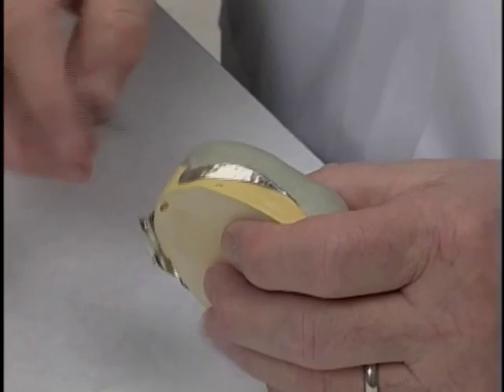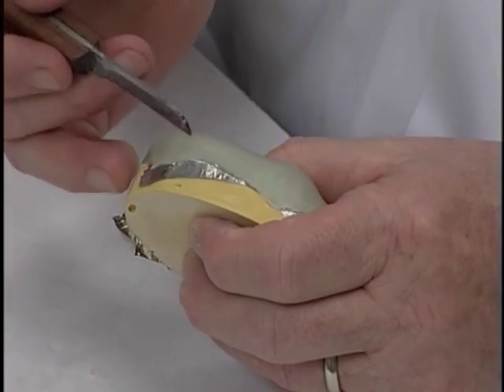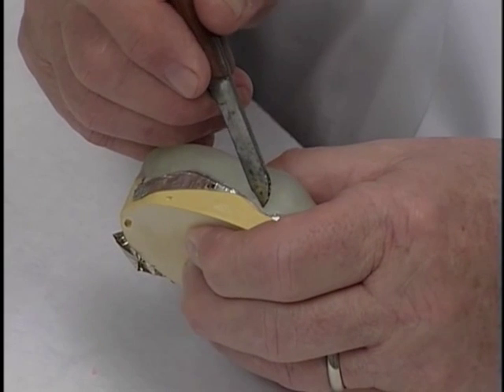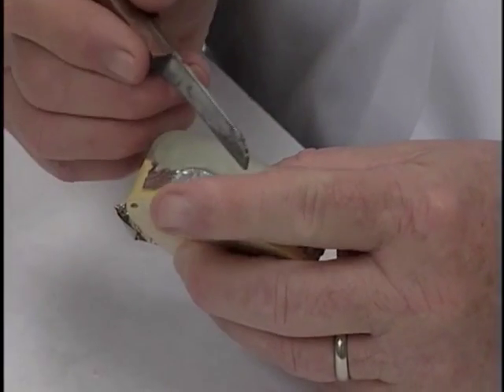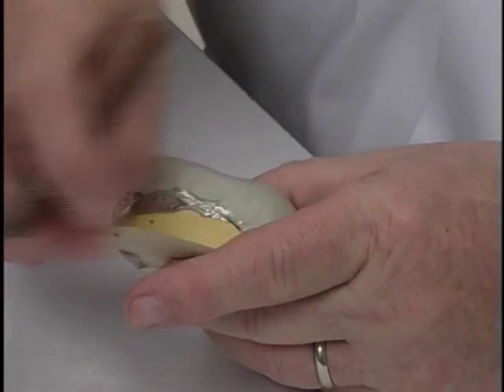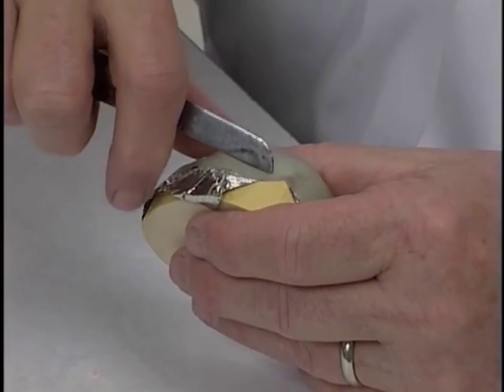Now, I remember before I put this on here that the black lines that we used were up from the periphery a little bit, so I'm going to cut the excess off of this also so that we don't have so much trimming to do once we get the tray constructed. There'll be a lot less trimming than if we left that material on there. So we can cut that off before we ever start because I know that's excess material.